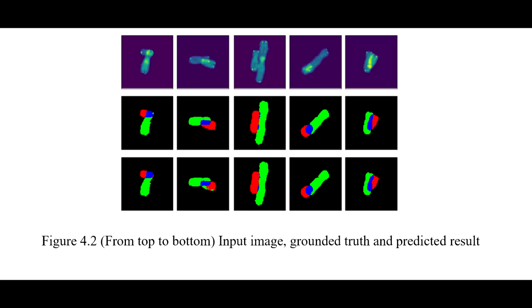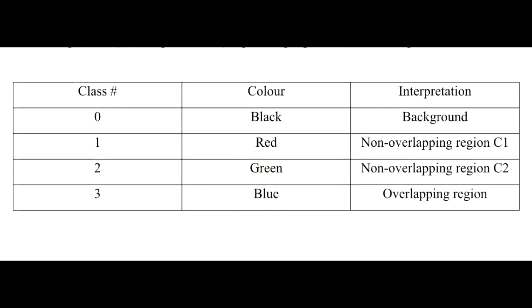A Kaggle-based dataset of 13,000 metaphase images was employed to train the model. The groups of non-overlapping regions are combined and integers are assigned to the class label values. Each chromosome is treated separately, and different activation functions and weights are used to get the optimal output.